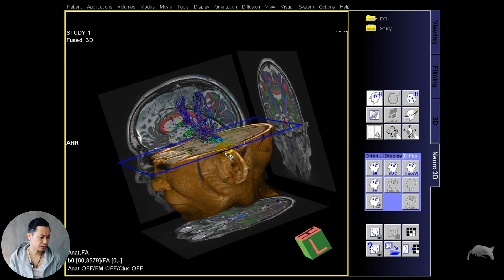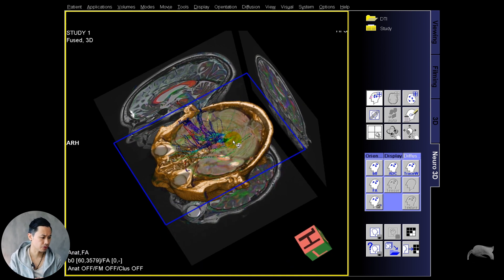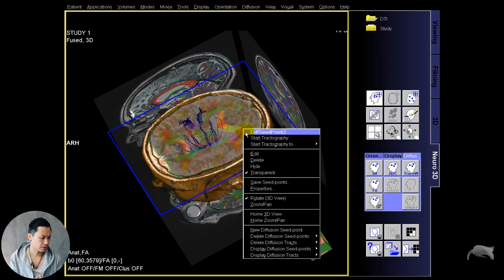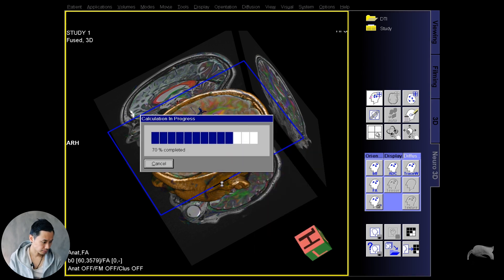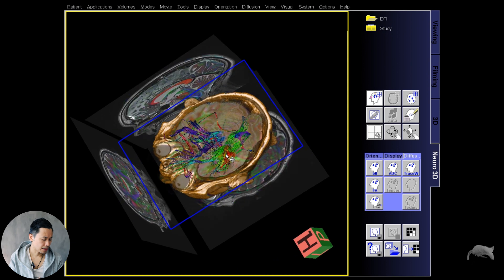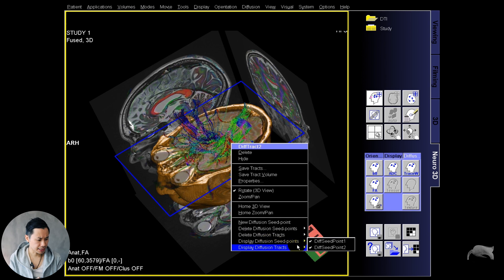You see, it's simple as that. You need to know the anatomy before you can do the post-processing. I'm just doing a fast post-processing here to show you how it can be done. I can use the shift button to check where the tracks are before I do the drawing of it and put on the seeds. Right-click now, start tractography. I also have different options if you right-click there - display seeds, points, and diffusion tracks. You just need to play around and test out what you need.